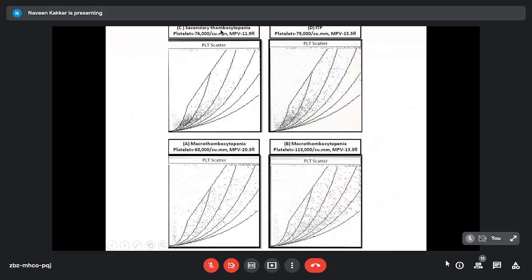The same in the two patients with secondary thrombocytopenia and ITP, now with platelet counts of 76 and 79,000, still you see the density here in the lower zones and some giant platelets. But look at the two other patients, except for the one that I've shown you, the macrothrombocytopenia I showed you in the first case, and another patient, platelet count of 1,13,000. There is no density in the lower zones. It's a very stark comparison between those two scatter plots. No density, all scattered through. Here your giant platelets are here, and here, because there is so much variation in giant platelets, many of them are plotted in the high volume zones. That's a very important pattern to recognize in patients with this condition.